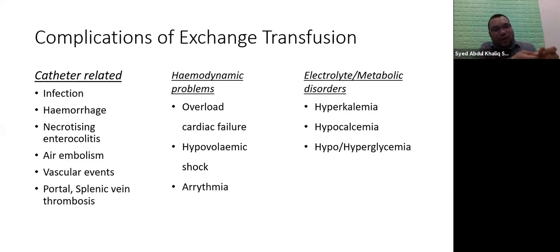That is why, when you aspirate blood, you should aspirate slowly. Over one cycle, you aspirate and push the blood back in, it should take around 3 to 5 minutes. It should not take less than 3 minutes. Minimum is 3 minutes, ideally around 5 minutes. So we pull a little, slowly, and push in slowly. So the process is slow. Then it won't cause problems to the heart, because a large volume of blood suddenly zooming out, your heart needs to compensate. Then you push blood in quickly, so venous return increases, shock like that. So, Starling law. Your heart cannot compensate with that huge amount of pressure. This is the problem.